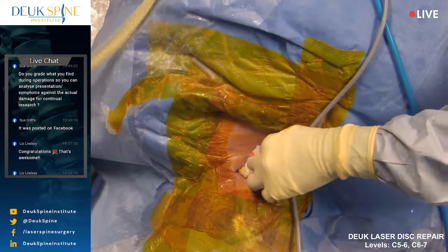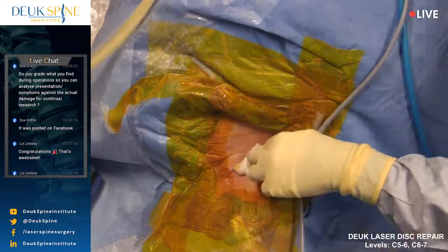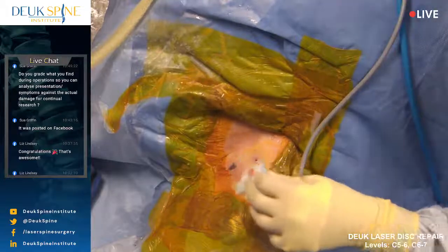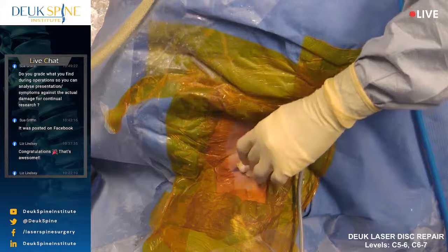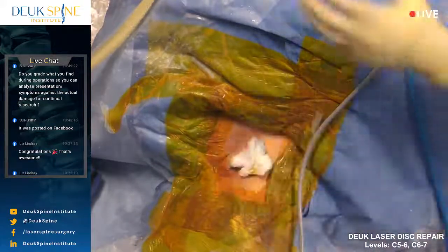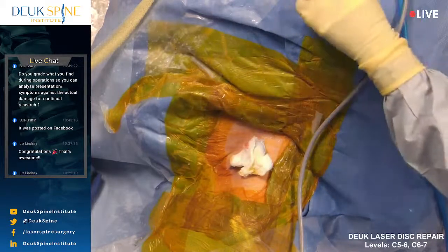Thank you, Monica. That was a tough one with that neck. When I was doing that lateral, that's what happened. The handle came right off and I couldn't do anything with it. So I'll have to, I think this comes off, and then there's a little wrench in there that can tighten it. Yeah, Luis, tell Luis to have a look at it. But I think you can pop that green thing off.